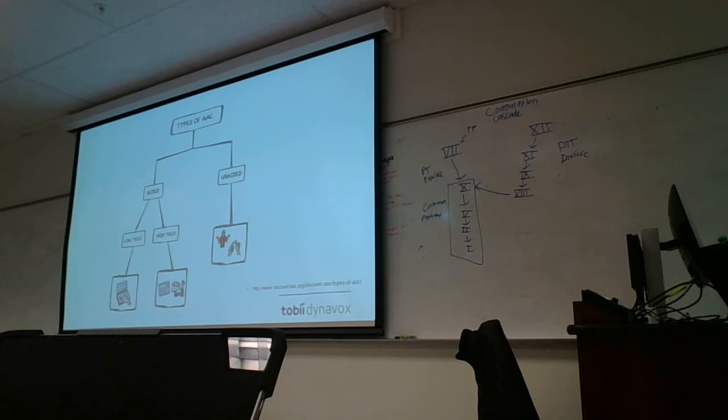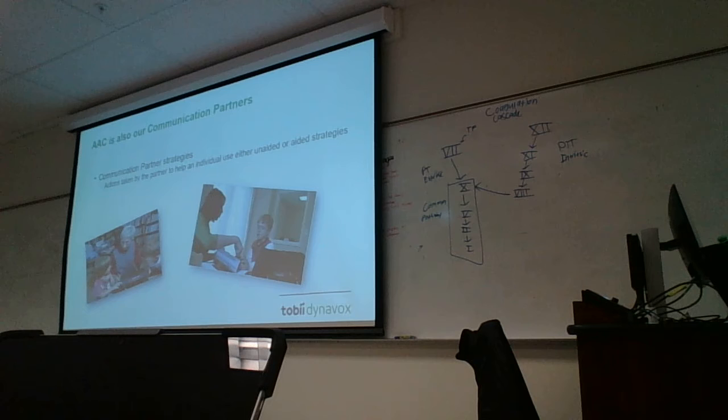And then eye gaze access is you look towards the device and it activates based upon the dwell time that is set up. And once you get some hands-on with the devices, you'll be able to have some more information about what I am discussing.